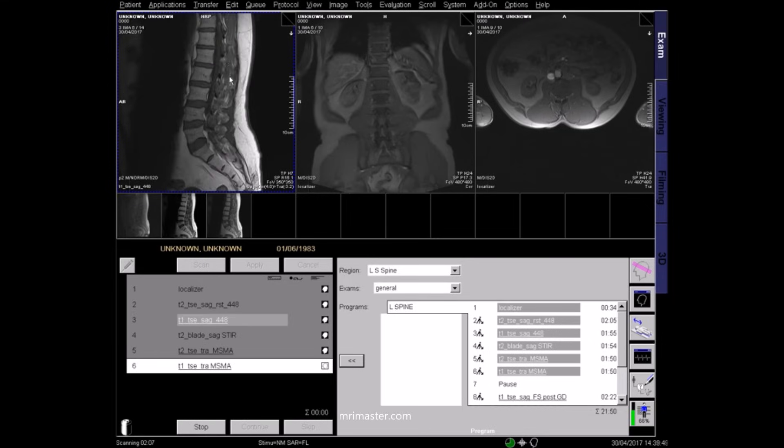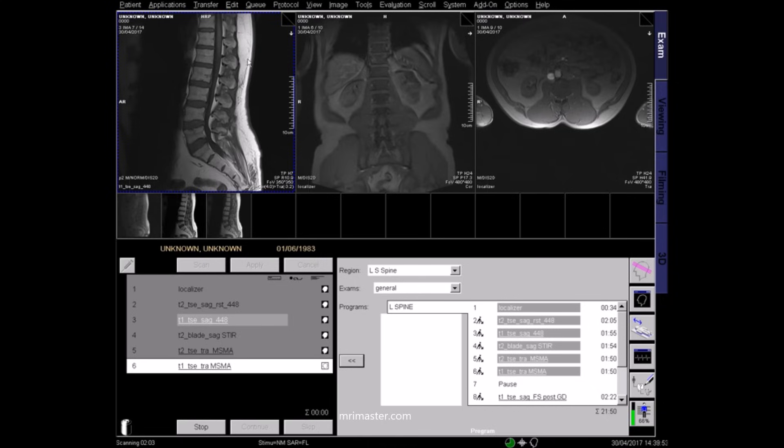This is a T1 sagittal image, where fluids appear dark and fat appears bright.